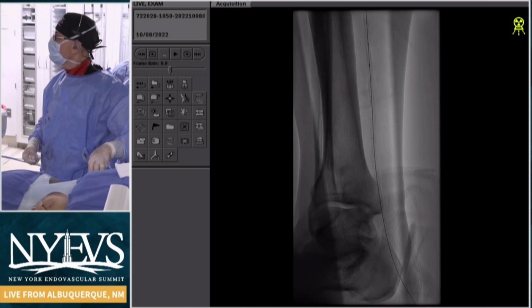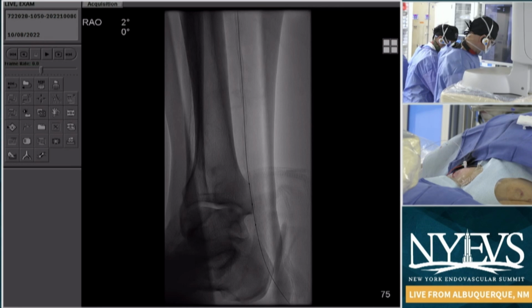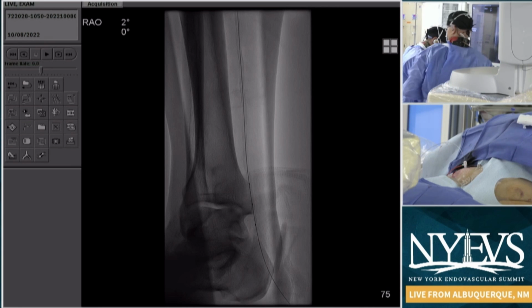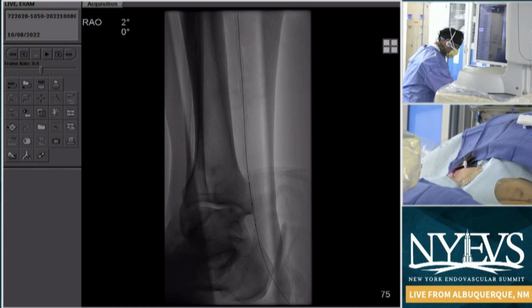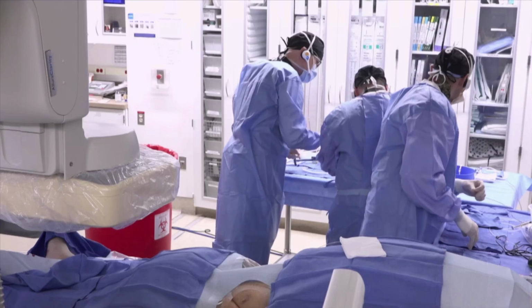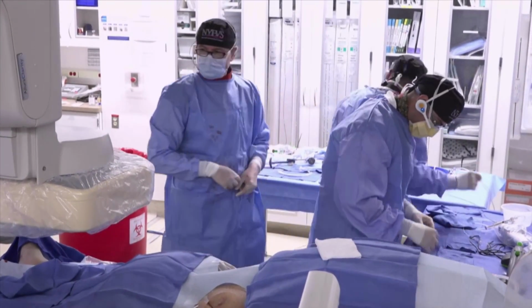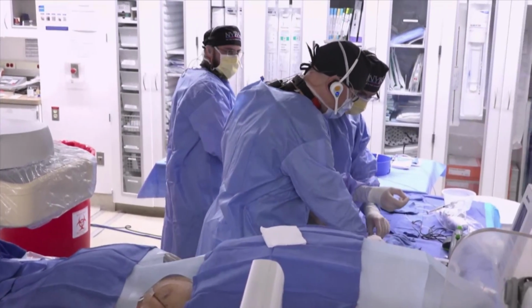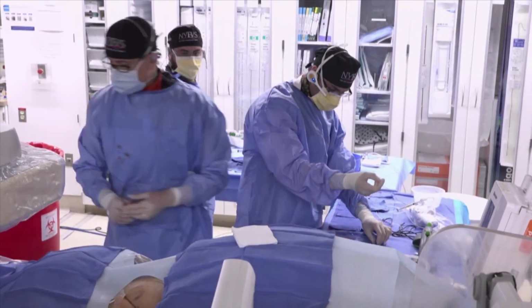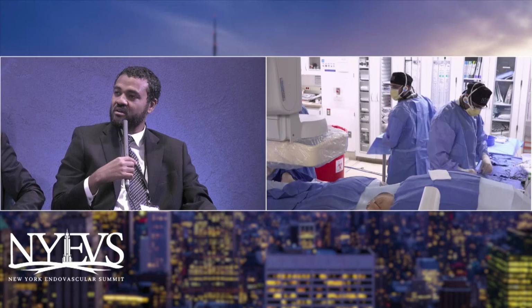So, Brian, as a vascular surgeon looking at this case, I assume you would have approached this from an endovascular first approach. Micropuncture access. Absolutely. That is a great point. You look at the difficulty of what he's having to do going distally. I've sewn in the vessels down in the foot and at the ankle. And when the target is terrible, you're in a bad spot. And actually the endovascular route can be a better option.